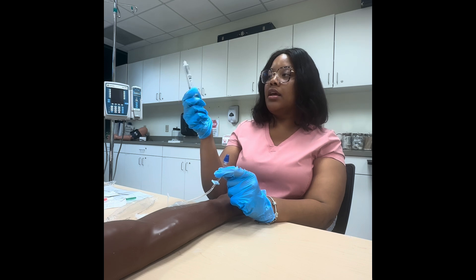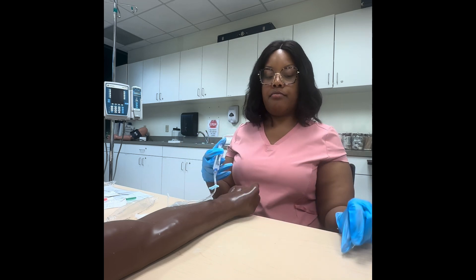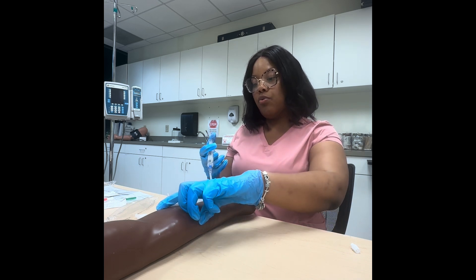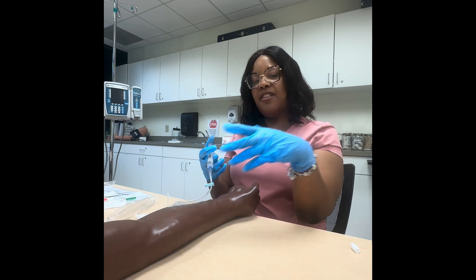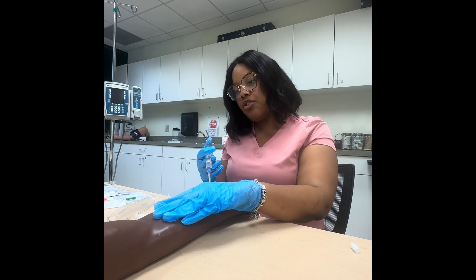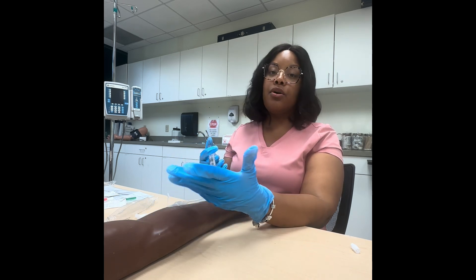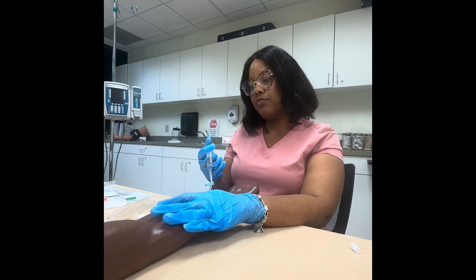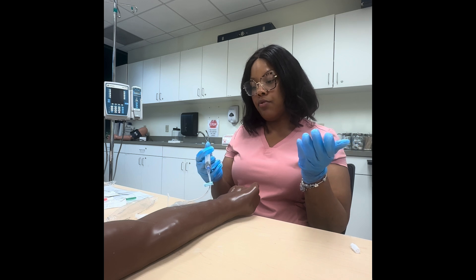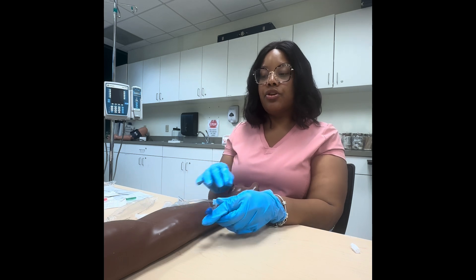Get the little bit of air out of your saline, then connect. There's no specific rate you need to push — just push at a steady rate. While doing that, feel above the IV site for any hardening or swelling, look to see if it's turning red, and ask the patient if they feel any pain or burning. If they say no, the IV is good. Go ahead and flush the rest of the saline in.